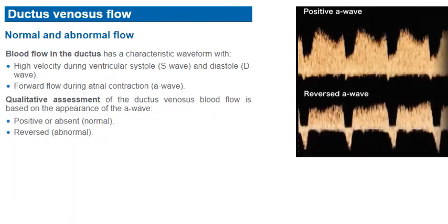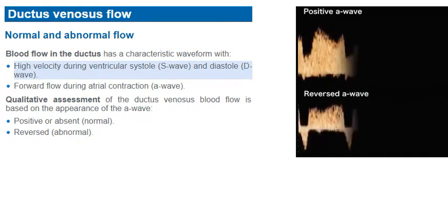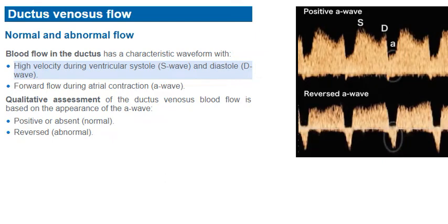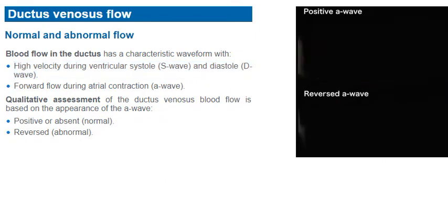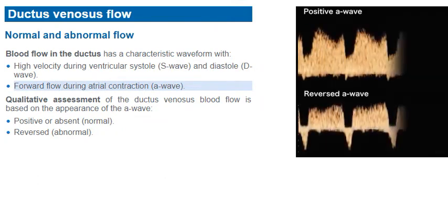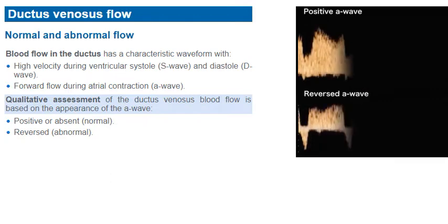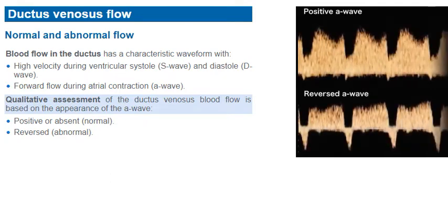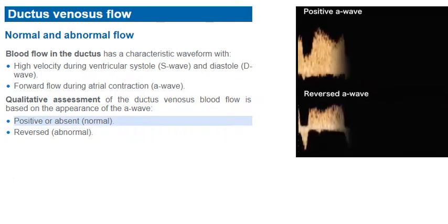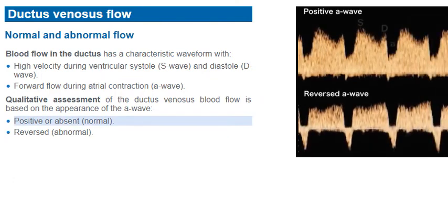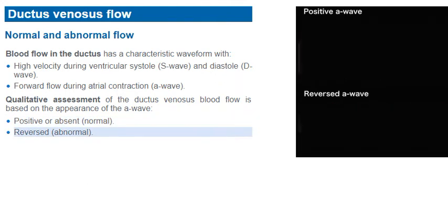Blood flow in the ductus has a characteristic waveform with high velocity during ventricular systole (the S wave) and diastole (the D wave). There is also forward flow during atrial contraction, the A wave. In screening for chromosomal abnormalities, qualitative assessment of the ductus venosus blood flow is based on the appearance of the A wave, which is classified as normal if the A wave is positive or absent, and abnormal if the A wave is reversed.